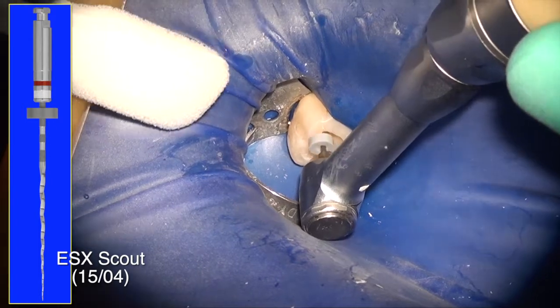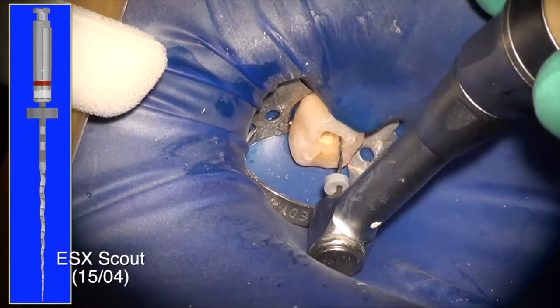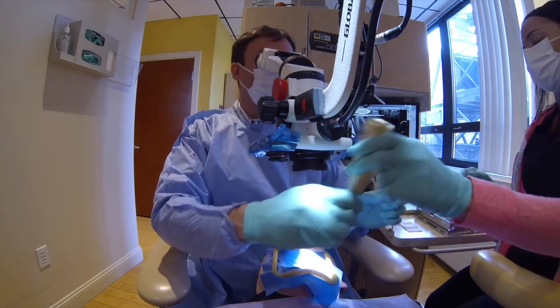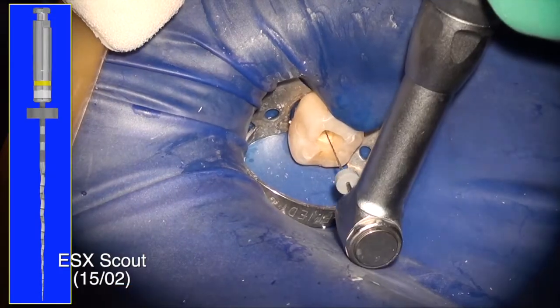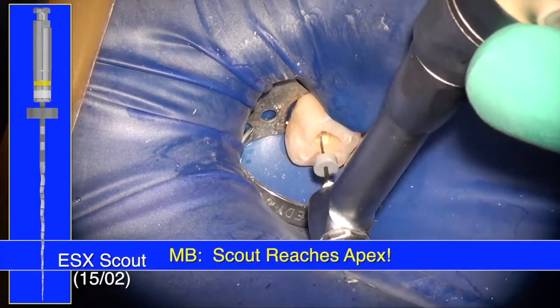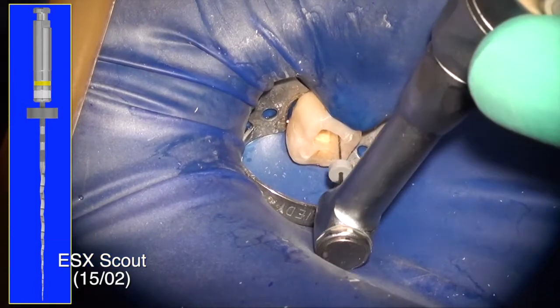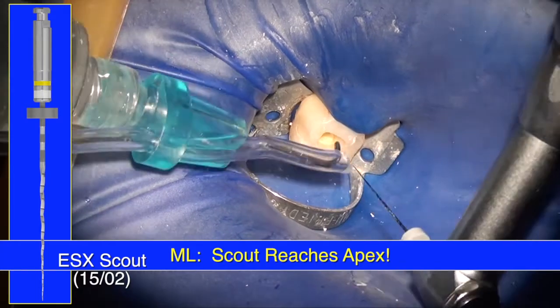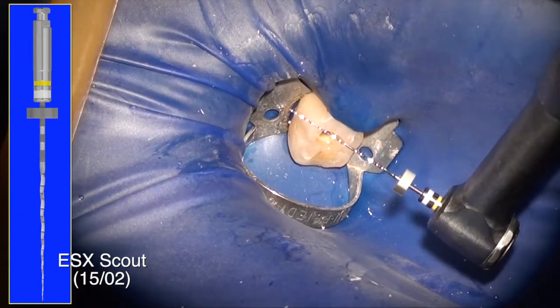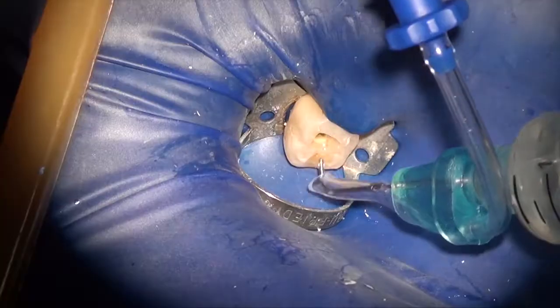I already had a size 6 down to the apex, so now I'm using a size 1504 and taking one stroke in each canal, and then the 1502, and take a look, the 1502 will now reach the apex. I basically ended up just taking two strokes, one of 1504 and one 1502 in each canal, and it reached the apex. Now again, putting some fresh hypochlorite in there.